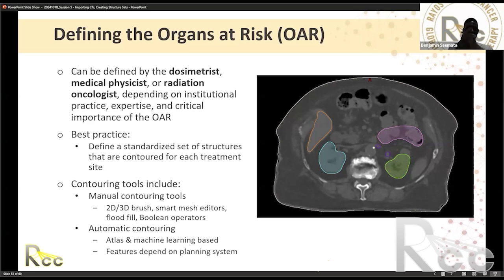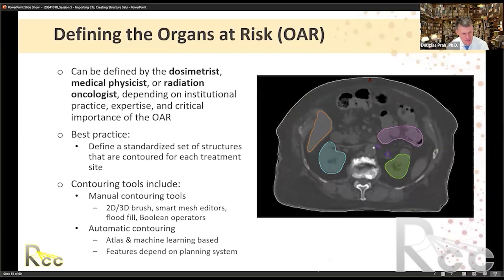Yeah, so excellent question. In our practice, it's become a function of the disease site and the immobilization. So if it's in brain and we have them in a head and neck mask, and we have a nice headrest in there that's comfortable, and the mask is quite tight, we might use like 3 to 5 millimeter margins on that expansion from the CTV.